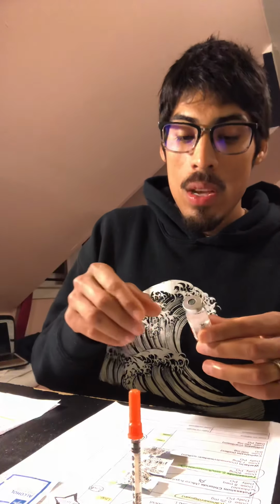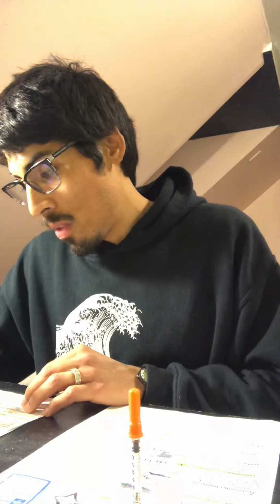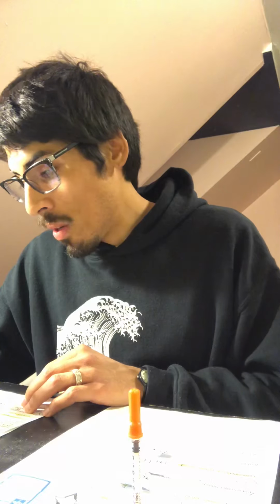you have to do hand hygiene once you walk in, so make sure you do that before anything. And so now we can go ahead and grab your insulin, because that's priority at this point. You want to make sure you check it again. So insulin, this one's 100 units per ml. It's a regular insulin, and expiration is 2/28. So that's our third check for that one.